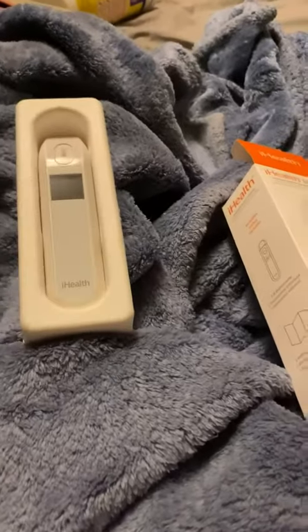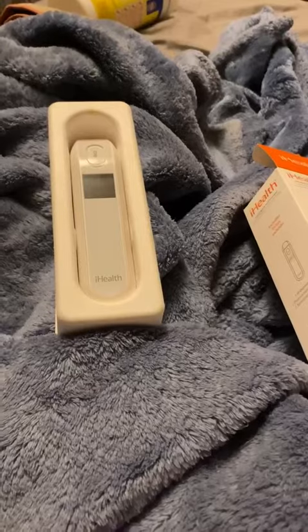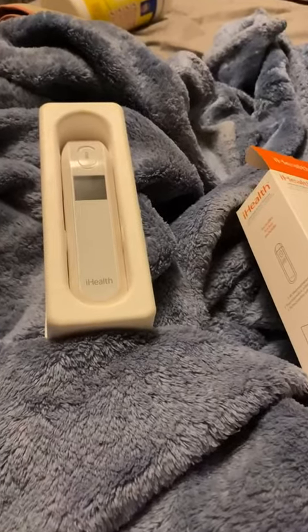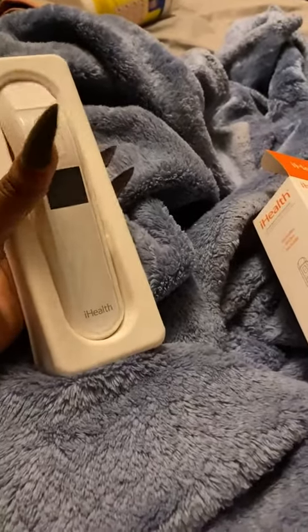This is a pretty nice little thermometer. I have another one too, but I think I like this one better. It feels a lot more sturdy and secure — it feels like it's better made.